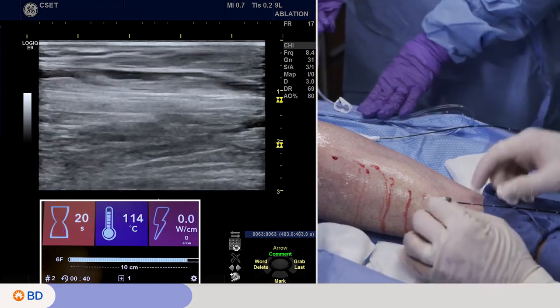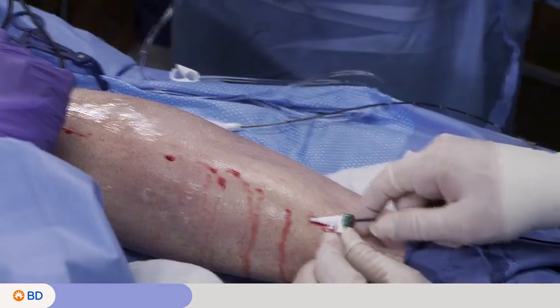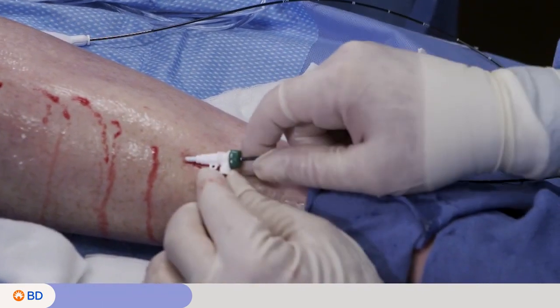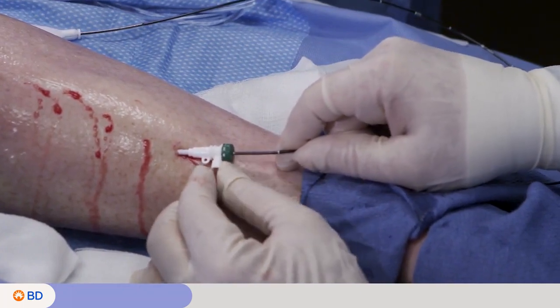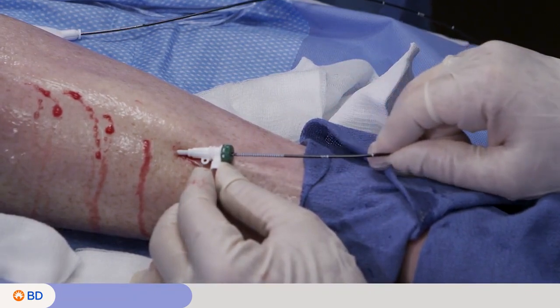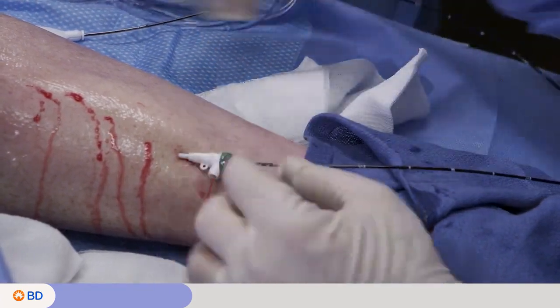So that's our second 20-second treatment cycle, and now we're going to pull back and do a tandem treatment. I have my marker here, and that's my start point. I'm going to use the hub to help me. That's 1, so that's 2.5 centimeters, 5 centimeters, 7.5, and 10. So that's the length of the coil, and now this is tandem. And we're also right at the end.